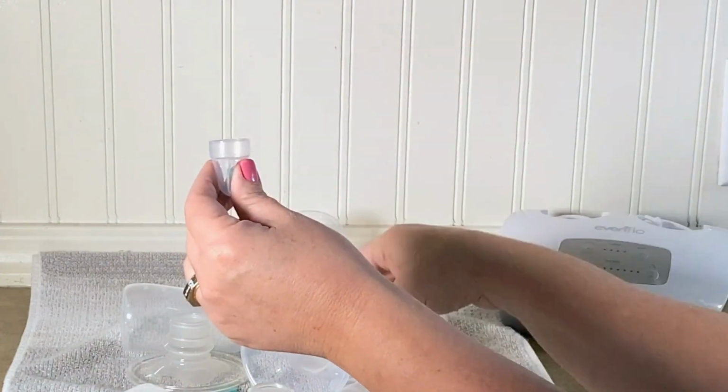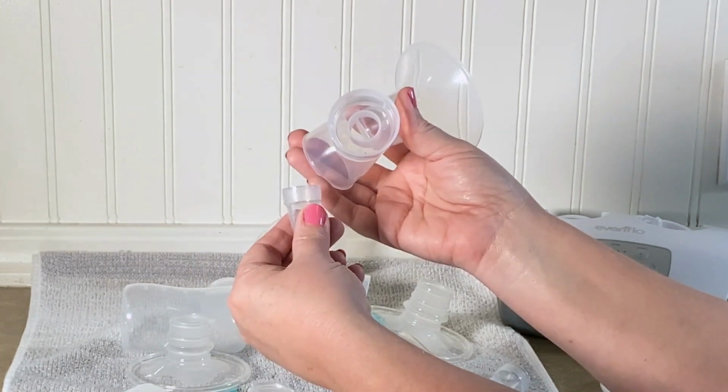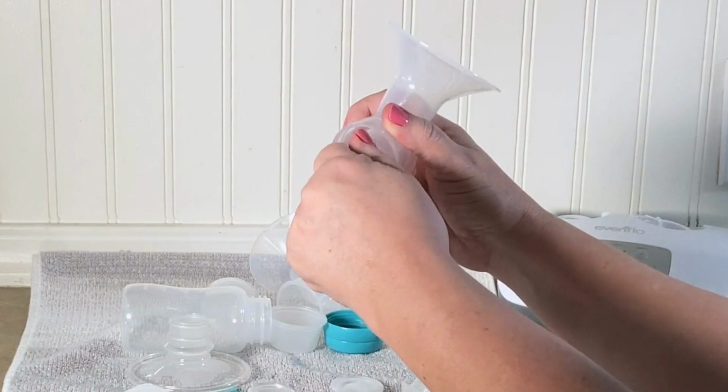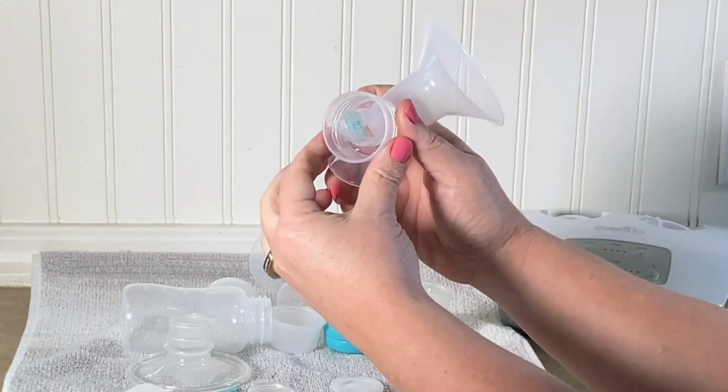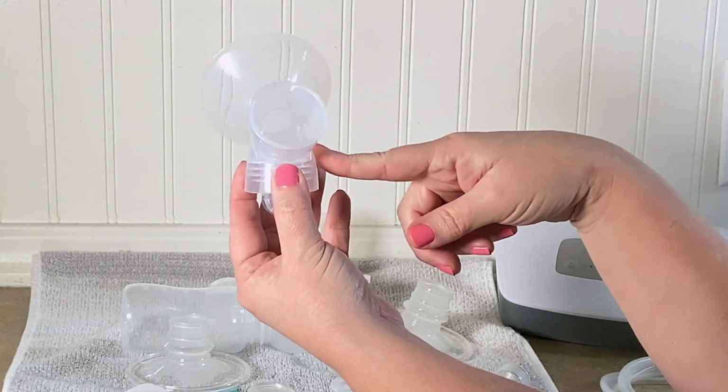Now we can grab a flange and find the end that we attach the valve and membrane to. I find it's easiest to grasp the valve and membrane with your thumb and finger, and as you're pressing it on, to give it a little twist. This will help you know when you have it all the way flush against the flange.